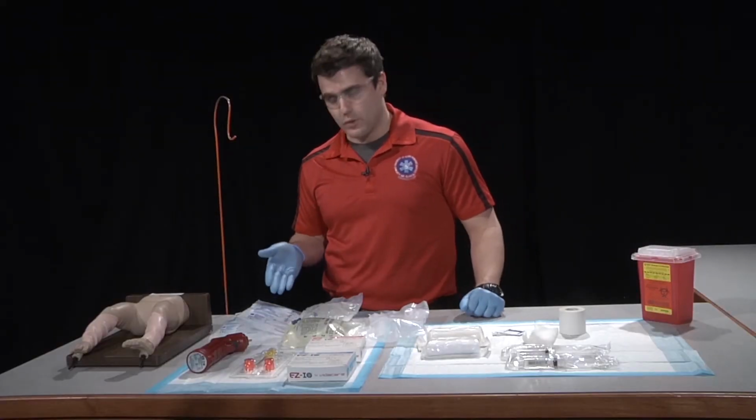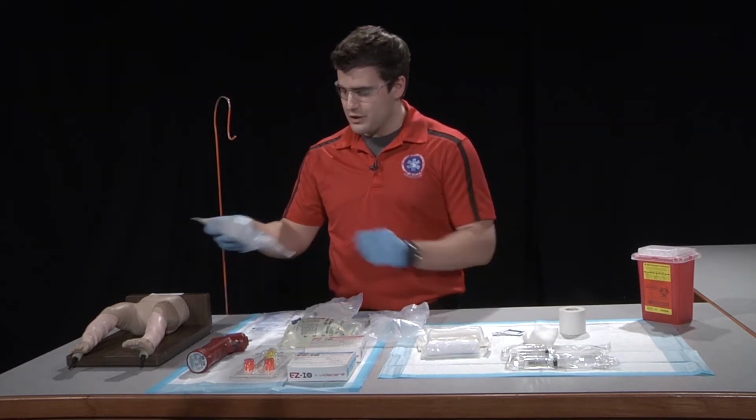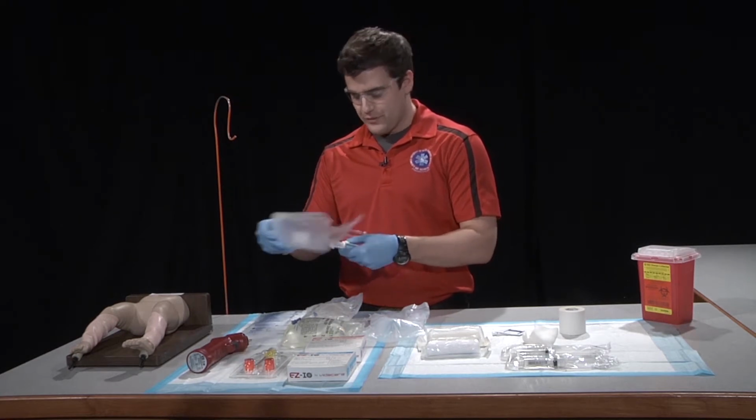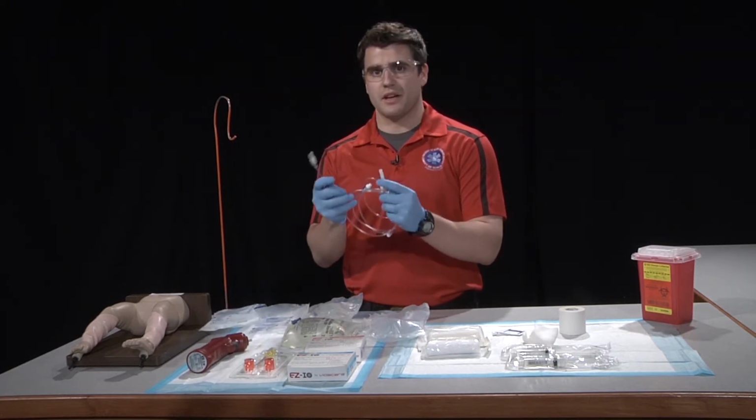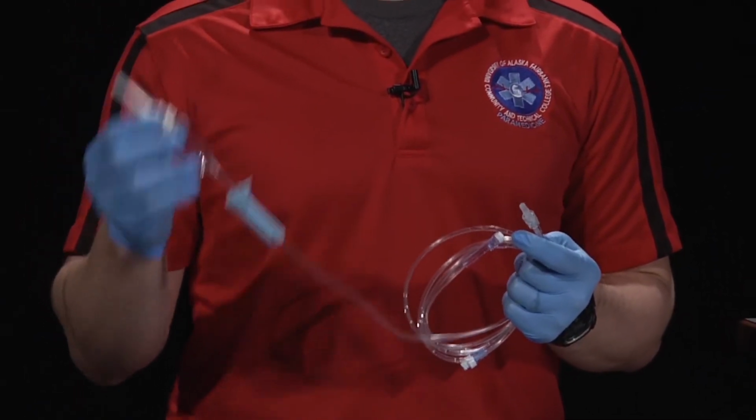Next, we want to make sure we have the correct administration set with the proper drip rating. We're going to remove it from the package, making sure it stays untangled, and make sure both ends still have the protective covers on the ports. Lastly, we want to make sure our flow clamp is close to our drip chamber.